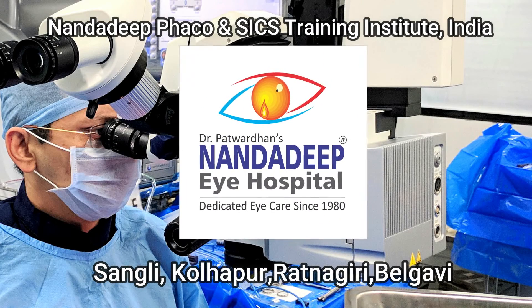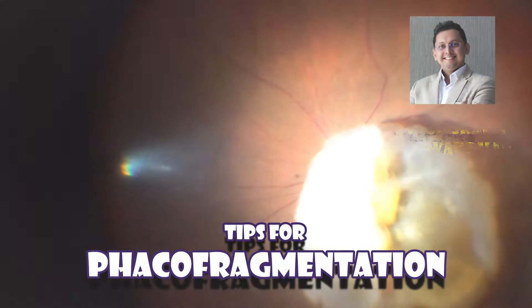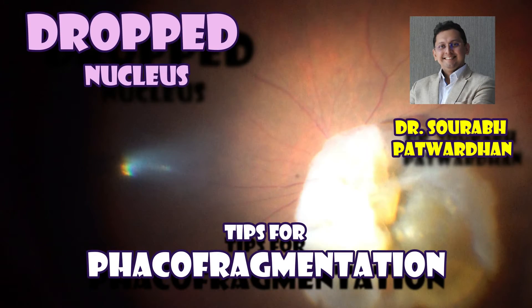Hello friends, I am Dr. Soura Patvadhan from Nandadeep Eye Hospital, Phaco-SICS Training Centre. In this video, I'll be showing the management of drop nucleus by a vitreo-retina surgeon and the tips for phacofragmentation.